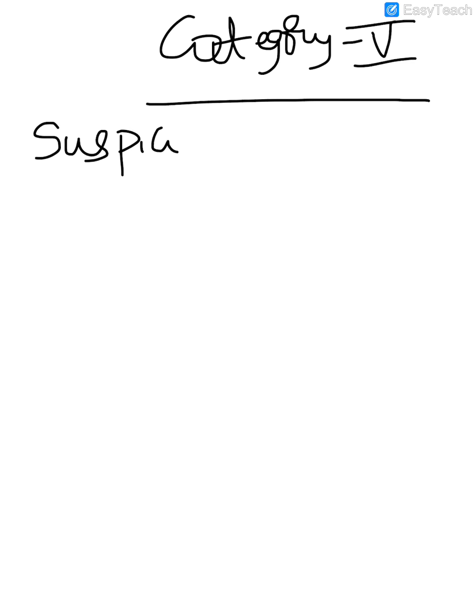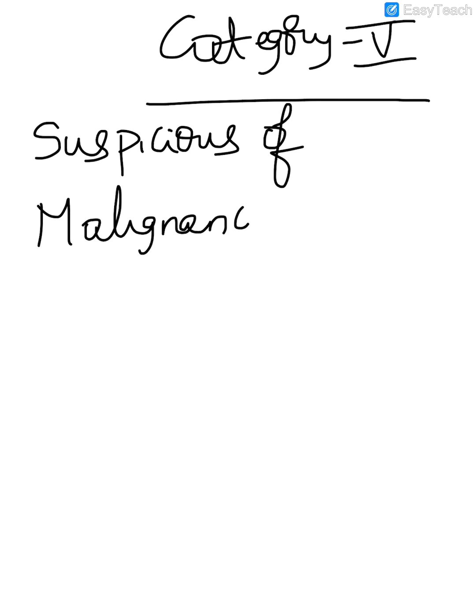Okay, all right. Next, coming to category 5 of reporting thyroid cytopathology of the Bethesda system. It includes suspicious of malignancy. Okay, suspicious of malignancy.